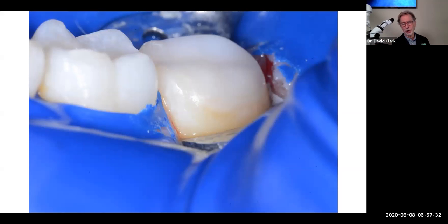And putting a zirconia crown on a lower second molar like this is pushing the cycle of death a lot faster, right? A gold onlay, yay. A zirconia crown, ugh. And a porcelain onlay here is hard to do because the tooth is short. So yeah. Other questions about this tooth before we move on? I want to talk about the histology of why this actually works and why the outcomes are so incredibly successful.